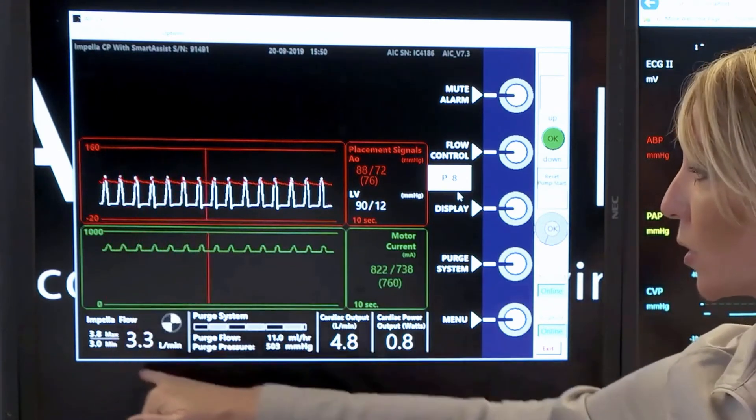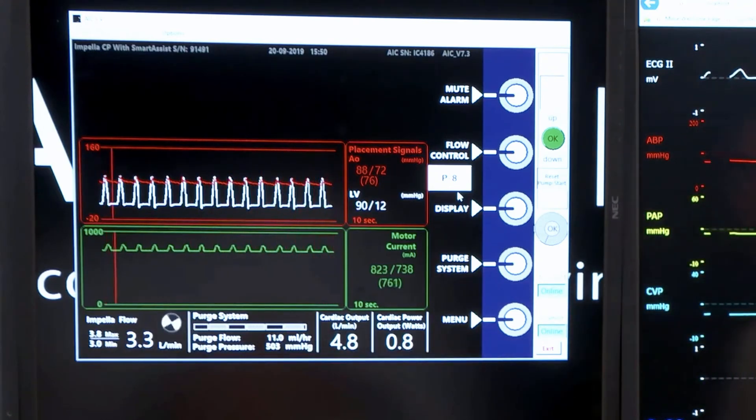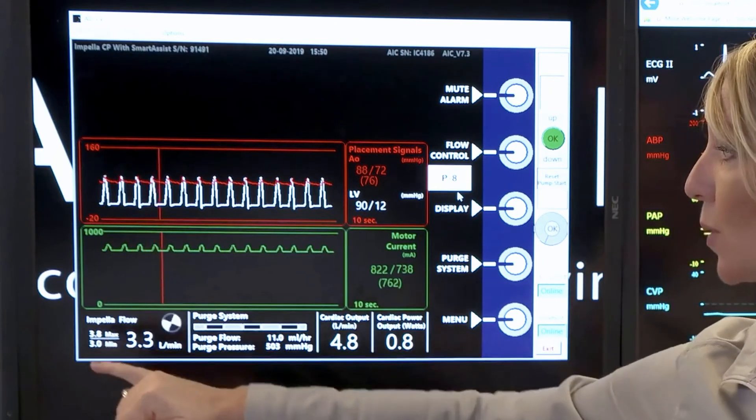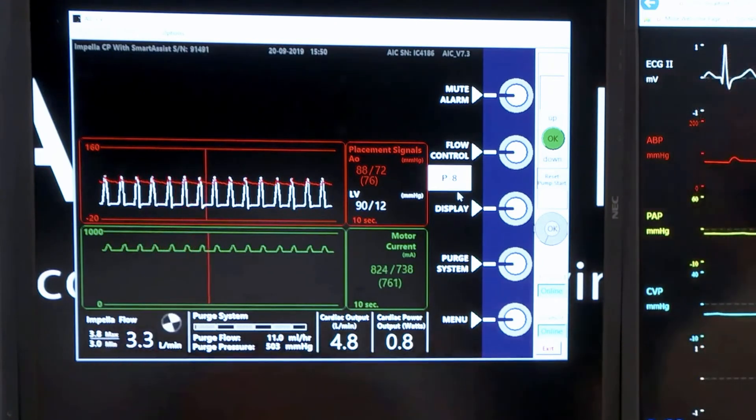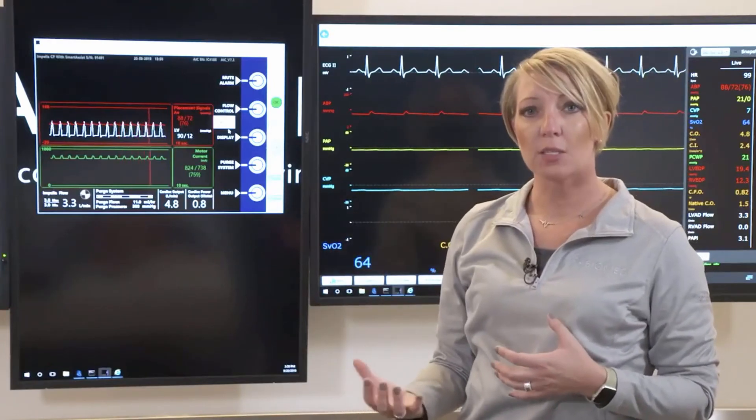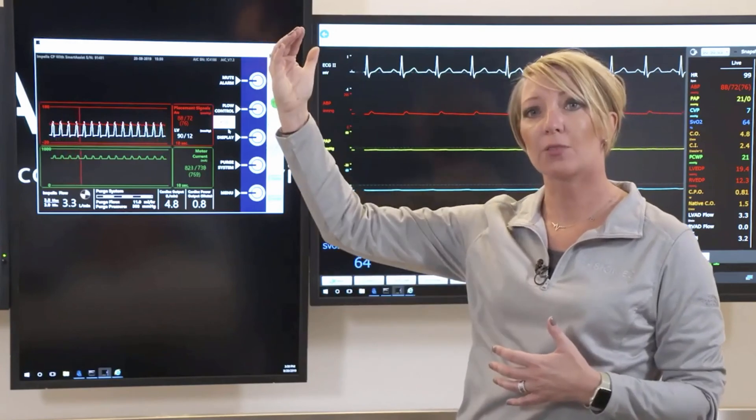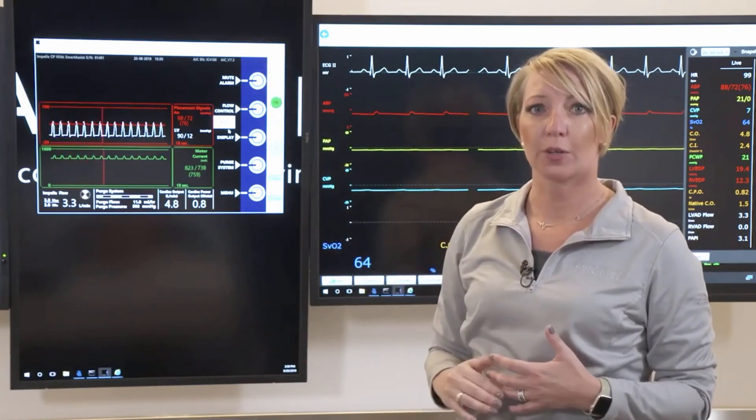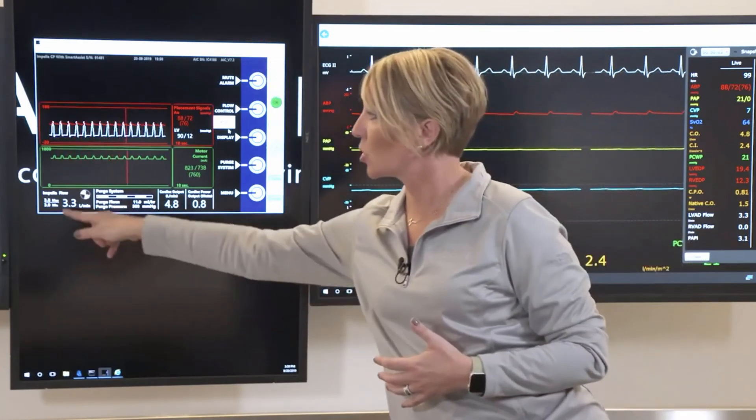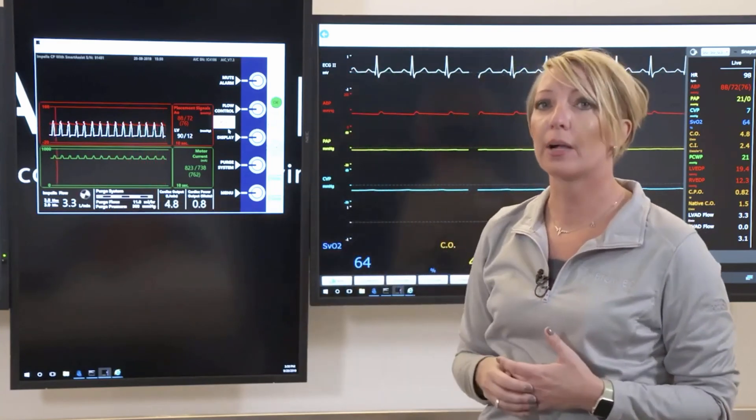You'll notice that the larger number here is giving the average amount of flow at that given P level. Max flows 3.8, min flows are going to be 3. So even though this is a continuous flow device, we still have the native heart working as well. So we will have a max flow and a min flow during the cardiac cycle. This is just the average amount of additional flow the Impella is giving.